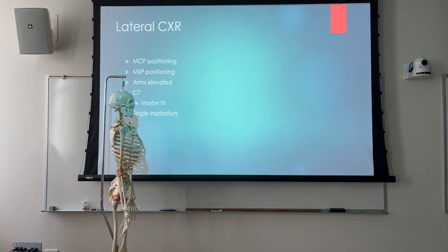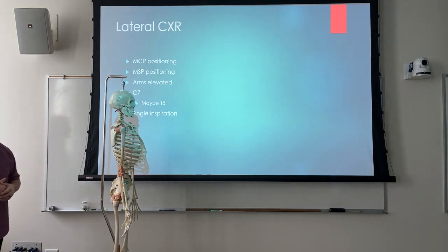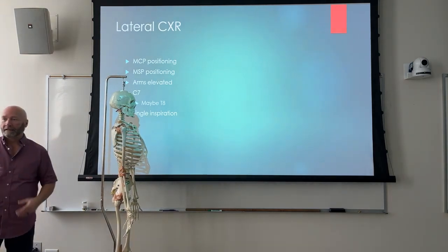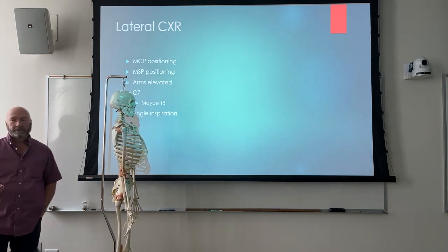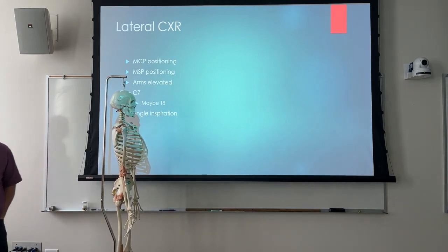So we're going to talk about the things that we're going to look at to determine rotation, how much rotation, according to the textbook, is acceptable, and really more of what you're probably seeing in clinicals. I didn't get a whole lot of lateral chest X-ray images from class, and I think that's because there's been a bit of a shift from the standard routine PA and lateral chest X-ray, just not doing a whole lot of laterals anymore. And we're going to talk about the importance of laterals in certain circumstances.